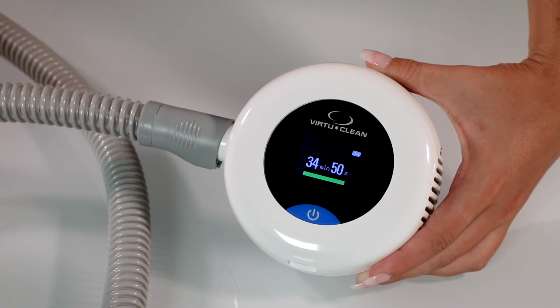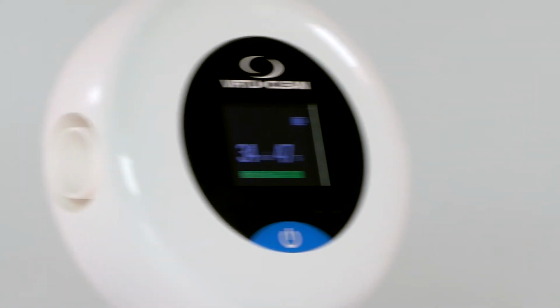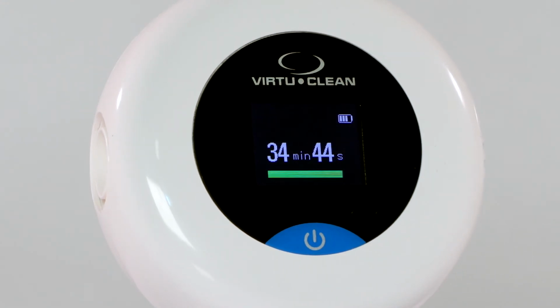The cleaning cycle lasts for 30 minutes, plus an additional 5-minute fresh air flush. The VirtuClean will automatically shut off when the total cycle is complete.